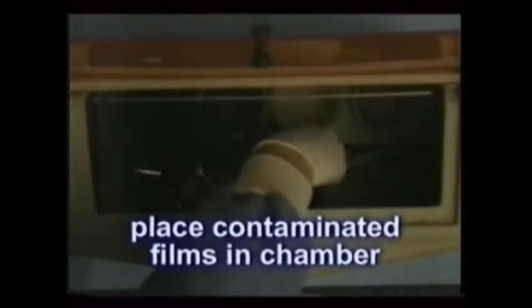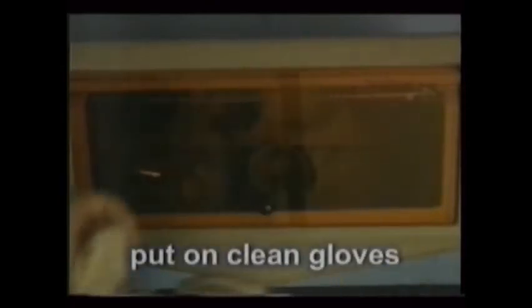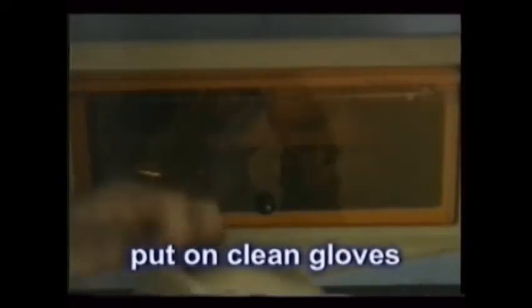First, place the cup of films to be developed into the chamber from above. Remove your gloves and close the orange or the red cover. Next, place new gloves, insert your hands through the openings, and then unload the film packets as described, inserting the film into the auto-processor or the cup of chemicals.